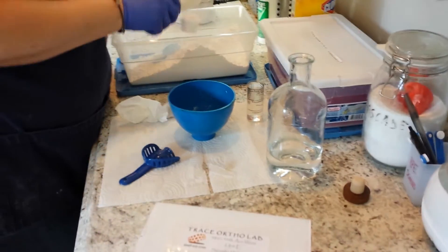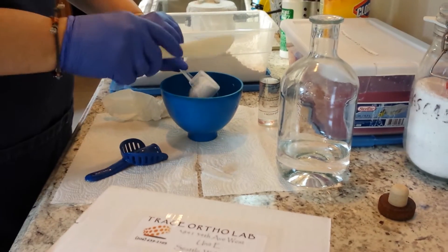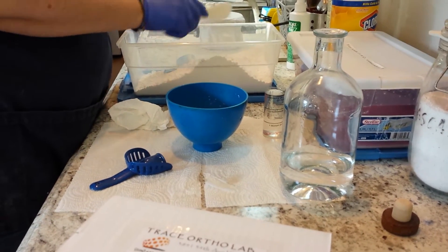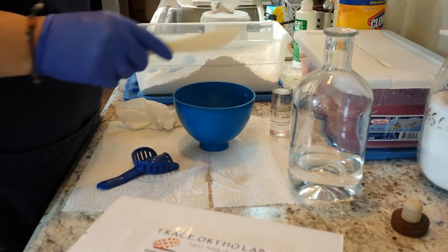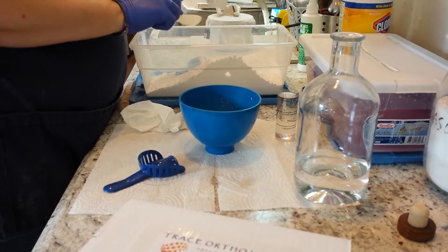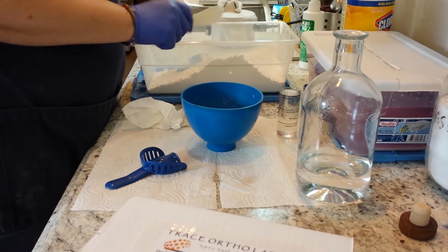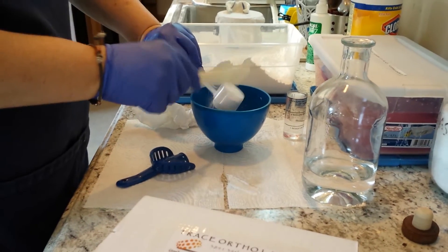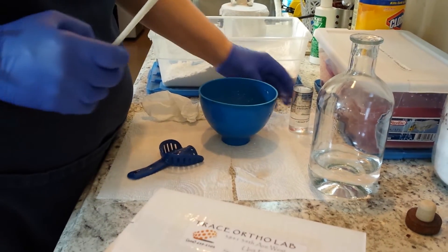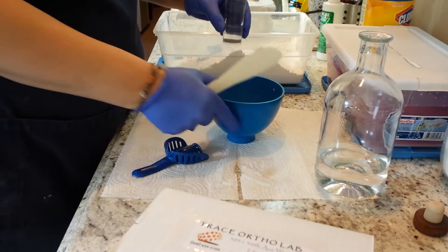Go ahead and mix your alginate. Since we're doing an upper, we'll go ahead and do three scoops of alginate. We want to do nice level scoops. We want to make sure that there are no bubbles inside — tap it down and scoop it across to make it even. That's three scoops.